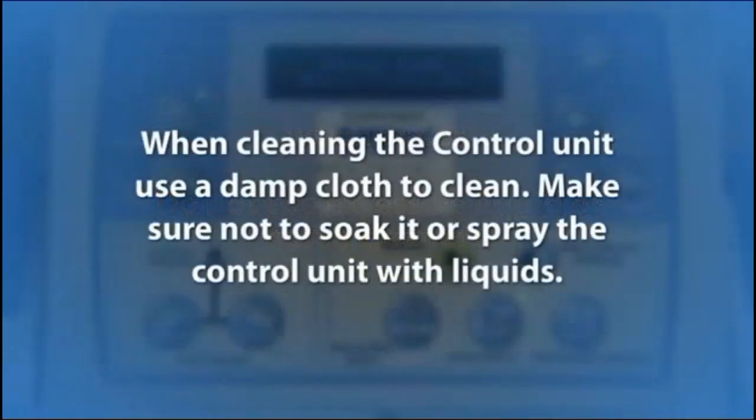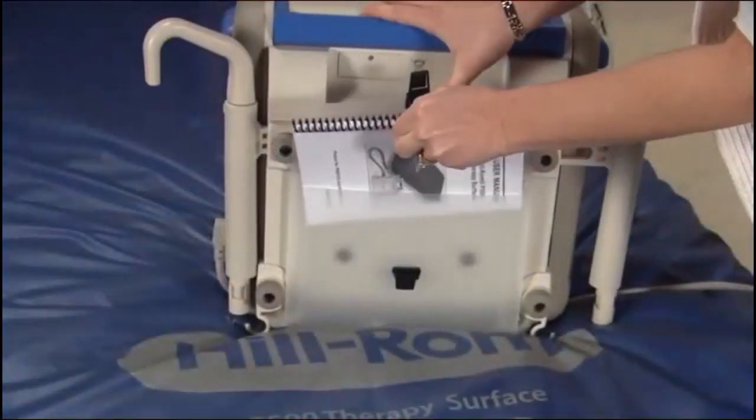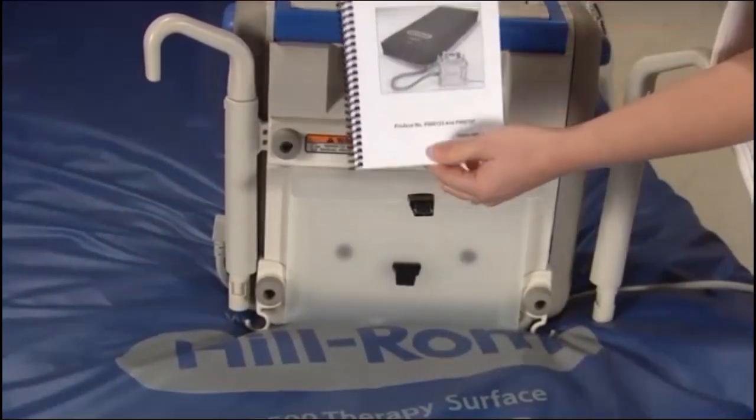When cleaning the control unit, use a damp cloth to clean. Make sure not to soak it or spray the control unit with liquids. Refer to the user's manual for additional cleaning information.